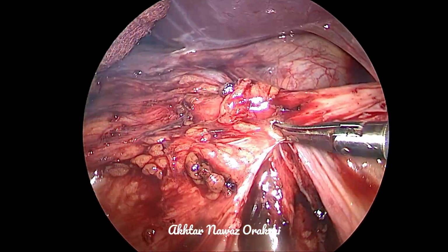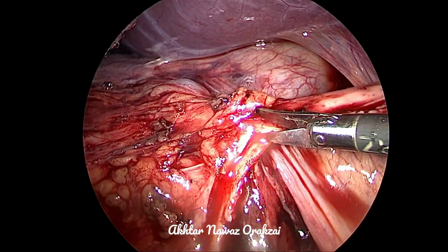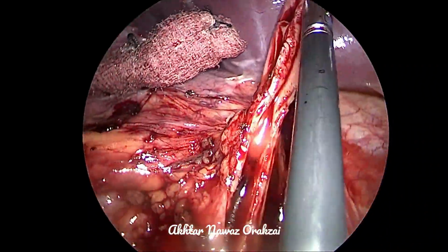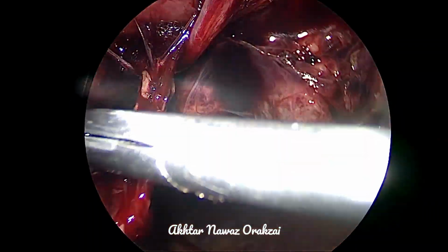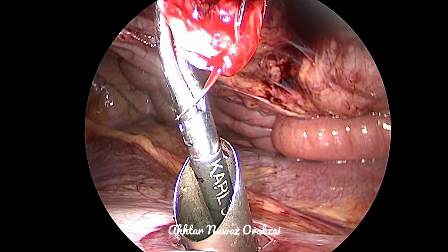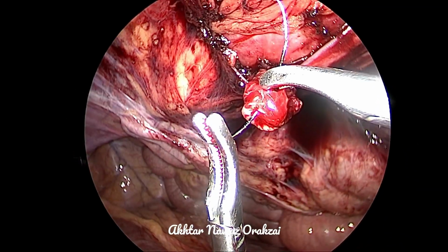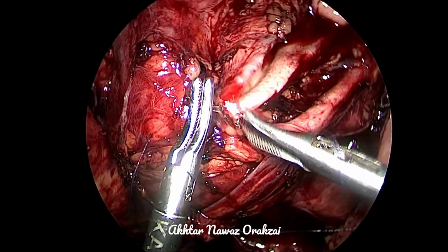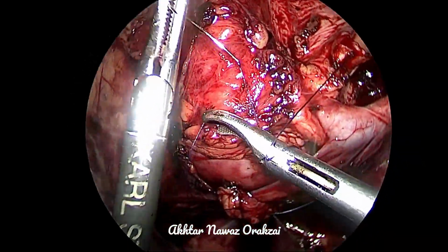So I usually cut the pelvis from below, and I leave the uppermost portion of the cut pelvis that can be used for retraction. And then we place a 4-0 Vicryl suture outside in the ureter, and then inside out in the pelvis, in the lowermost part of the pelvis.